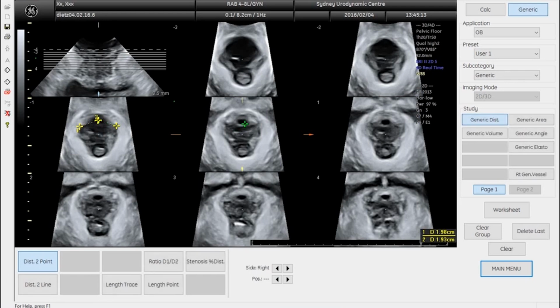This is a very strong muscle. It's much thicker than average. It looks athletic, to say the least, and we're not surprised to see that all those measurements of the levator-urethra gap are well below the cutoff in Caucasians, which is 2.5 centimeters. Incidentally, further up, of course, the muscle is just as normal here.